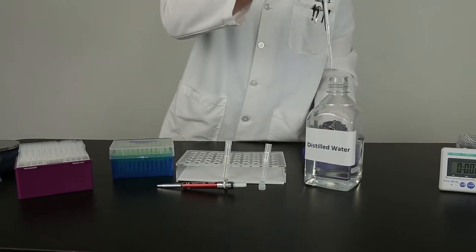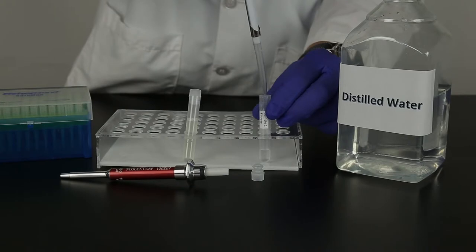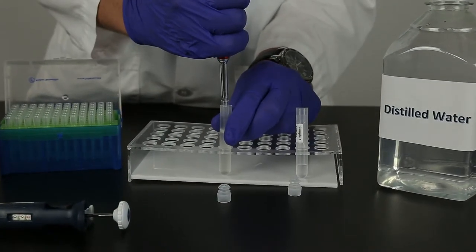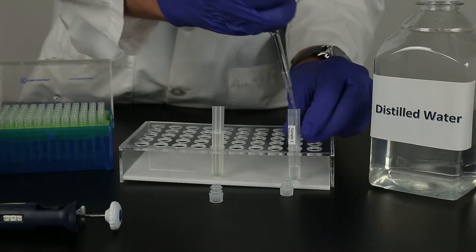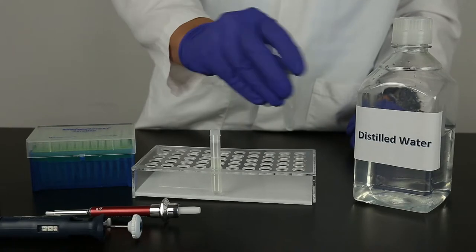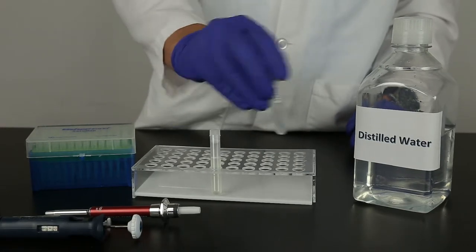Dilute the sample filtrate 1 to 10 by mixing 900 microliters distilled or deionized water with 100 microliters sample filtrate in a clean sample collection tube. Mix well. Label this tube diluted filtrate. Your sample is now ready to test.